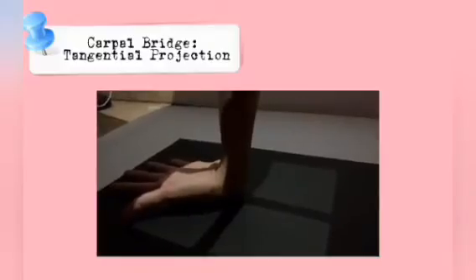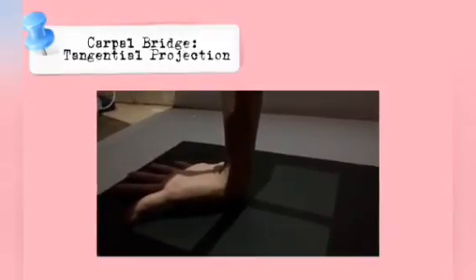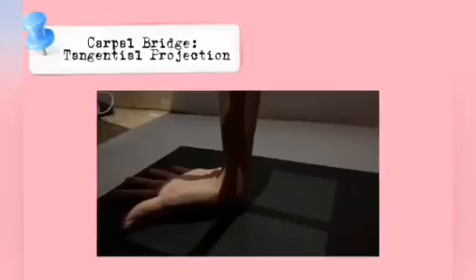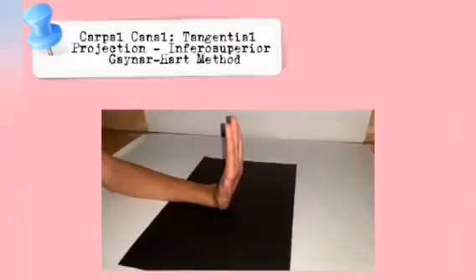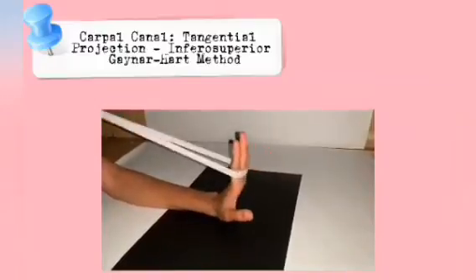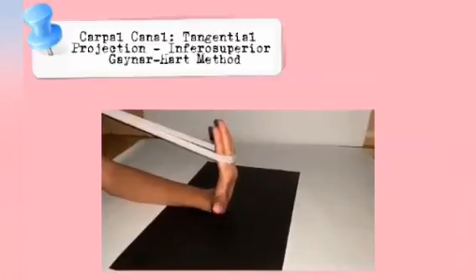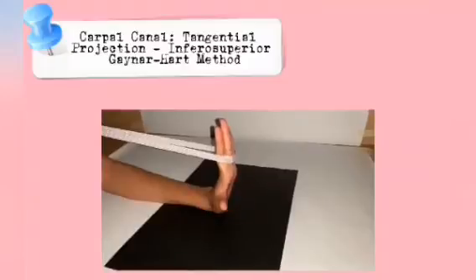Tangential projection. Position of patient. Sit or stand the patient at the side of the radiographic table to permit the required manipulation of the arm or X-ray tube. Position of part. Hyperextend the wrist and center the IR to the joint at the level of the radial styloid process. For support, place a radiolucent pad approximately 3/4 inch thick under the lower forearm.